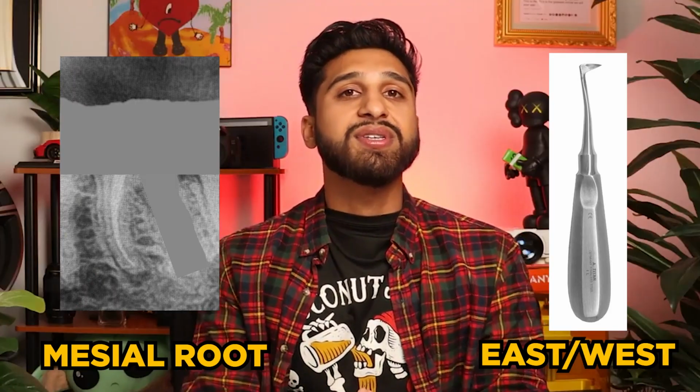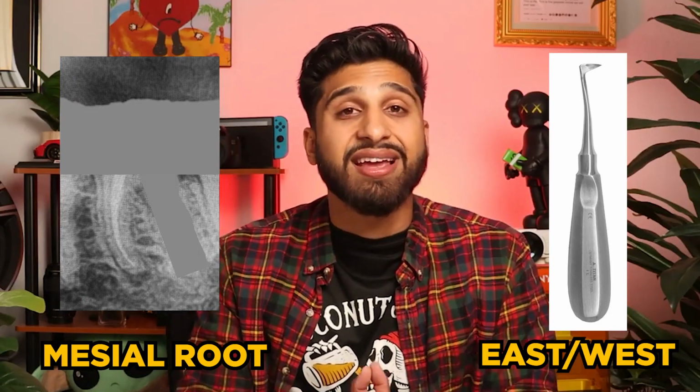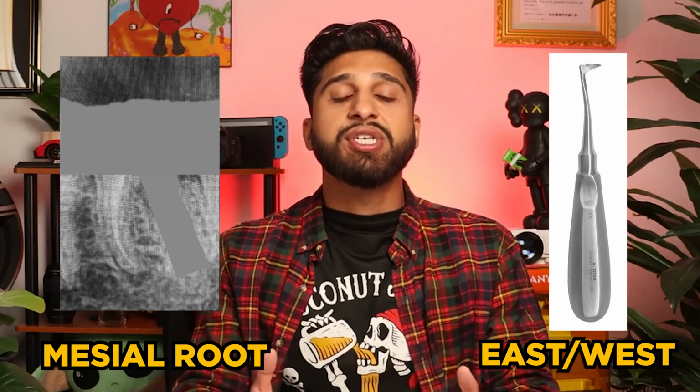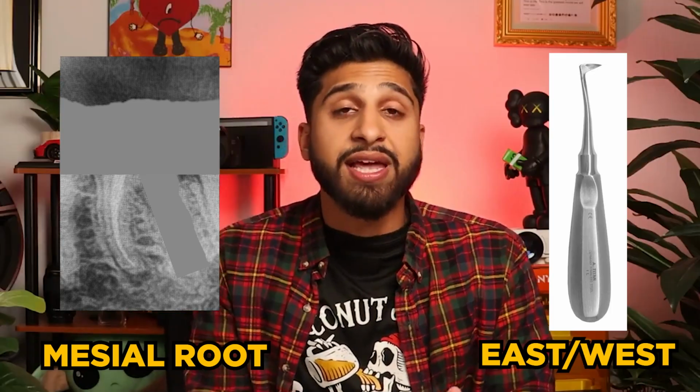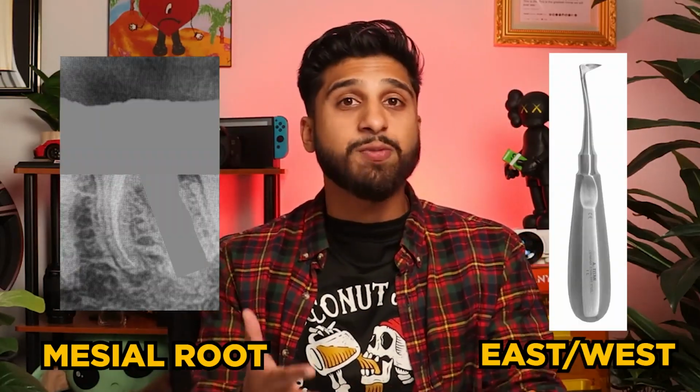In such situations where a lower molar root tip breaks in an open socket, my preferred instrument of choice is a wonderful tool called the East-West. I was able to use this instrument to access the mesial side of the canal, which curves distally. By strategically positioning the East-West instrument, I gently applied pressure trying to move the root tip towards the space we created, towards the furcal bone. And repeating this action a few times, I gradually expanded the socket.